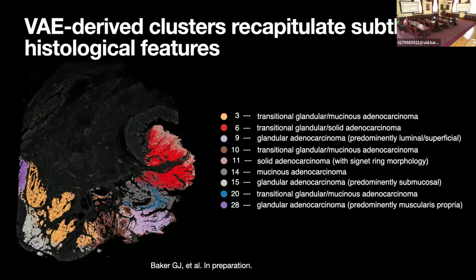So you say, oh, well, you just got different neighborhoods. The window is small enough, and this Gaussian window sort of de-emphasizes the neighboring pixels. So this is really just the texture in the cell that can tell you this fine level of detail about cellular location and tissue niches.